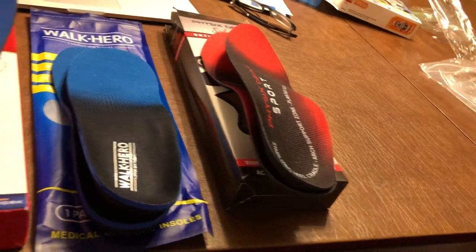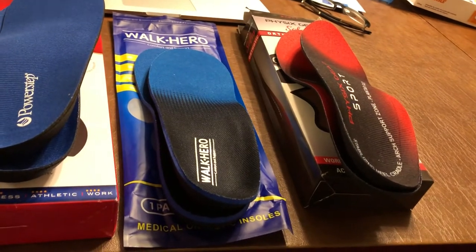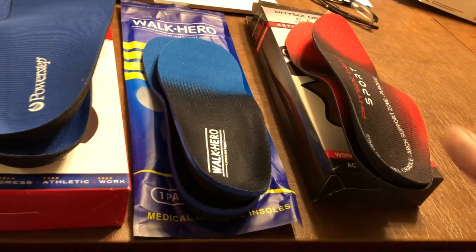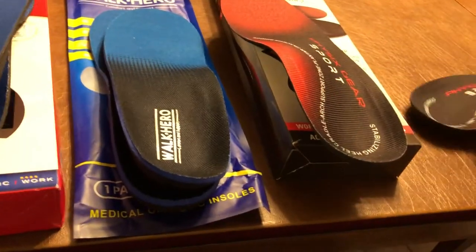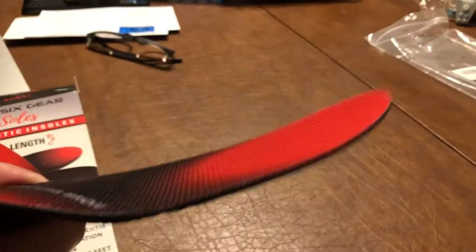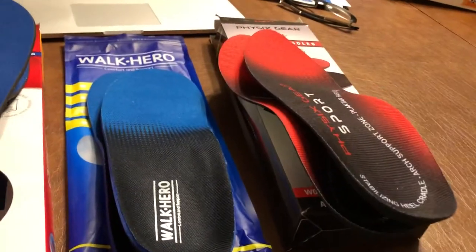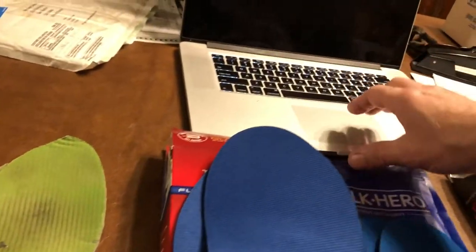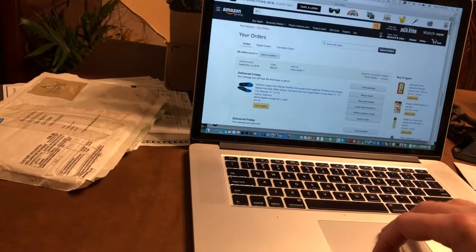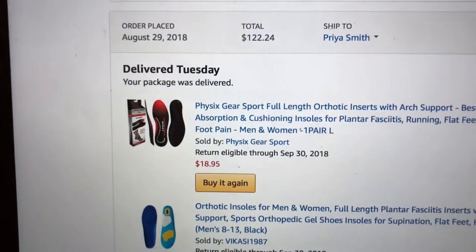So I'm going to try the Physics Gear Sports for sure. The reason I won't test the others is that I'd have to cut them to fit and then can't return them. For me, the ideal insert has good stiffness, a truly high arch, and thinness in the front so my foot isn't elevated further. The Physics Gear Sports were $18.95, and if they work out I'll definitely hit buy again.